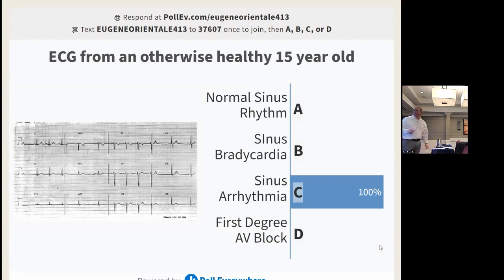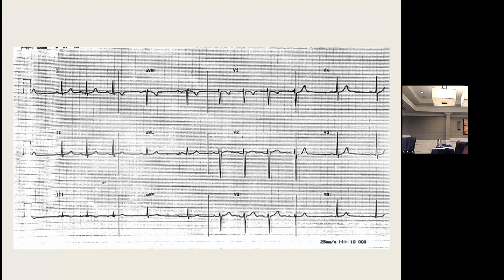Sinus arrhythmia. So if normal sinus rhythm, what we just saw with our validity check, that perfectly drawn EKG, was the standard. Notice how here, remember when we read EKGs, we're looking at 3 leads simultaneously. The infinitesimal line, there's nothing that is that narrow and that high other than a pacemaker spike, okay? There's nothing on an EKG, and what's happening is the leads are changing. So we're looking at 3 windows, and then all of a sudden, simultaneously, we're looking at 3 new windows, and then 3 more. So these 3-second segments are 3 different leads.